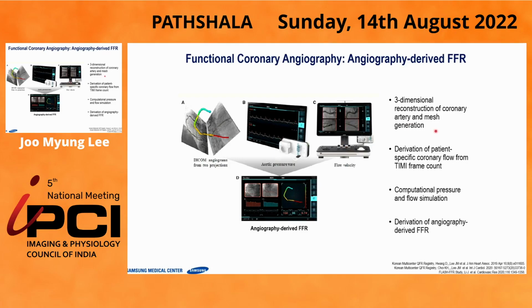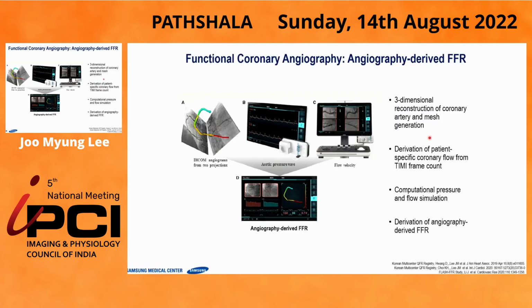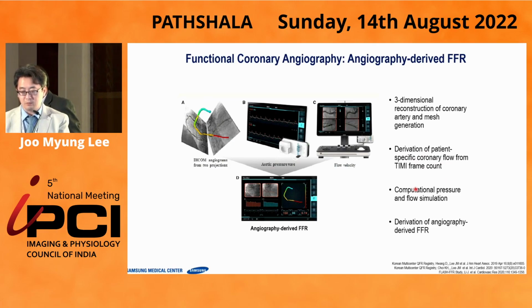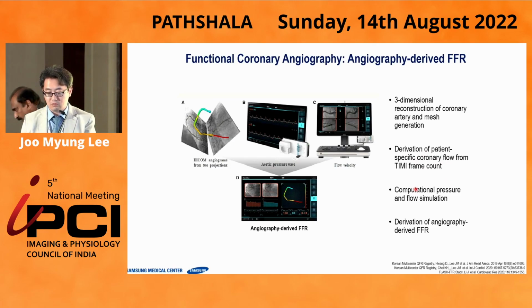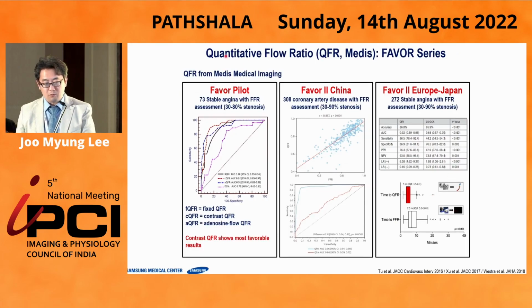Technology started with the three-dimensional reconstruction of coronary arteries using the 3D QCA, and then applying patient-specific coronary flow from TIMI frame count, and then applying the CFD or mathematical calculation, we can derive angio-based FFR. So QFR is one of the first modalities of angio-derived FFR.